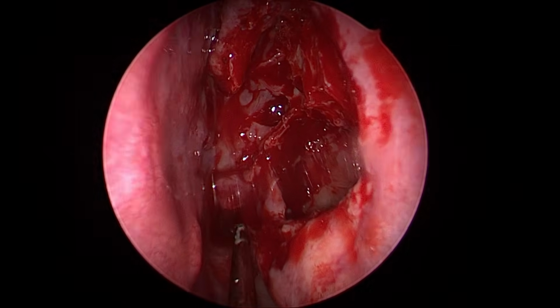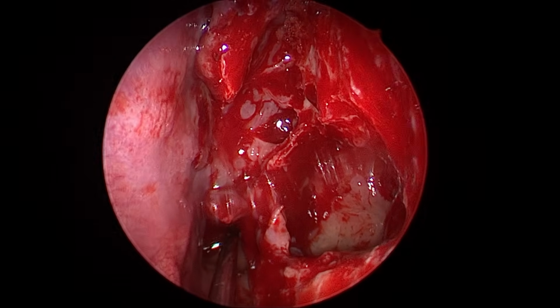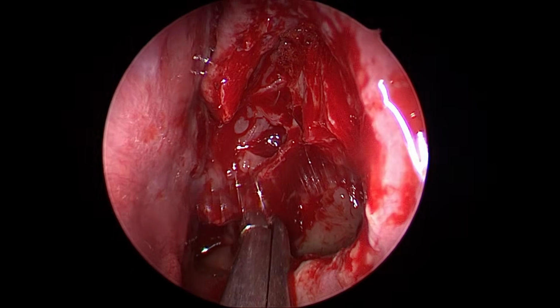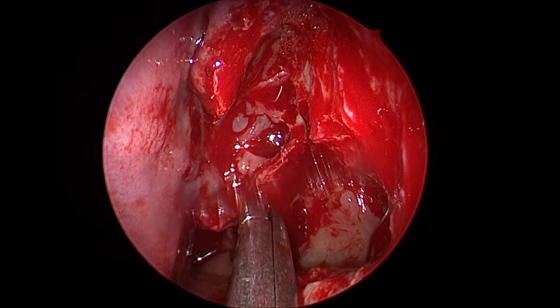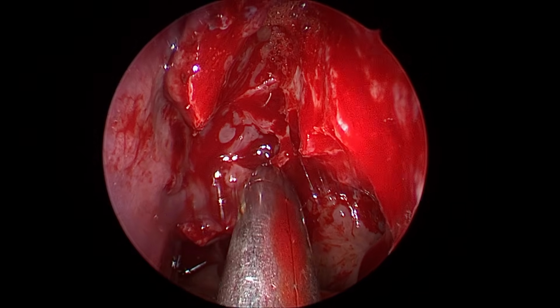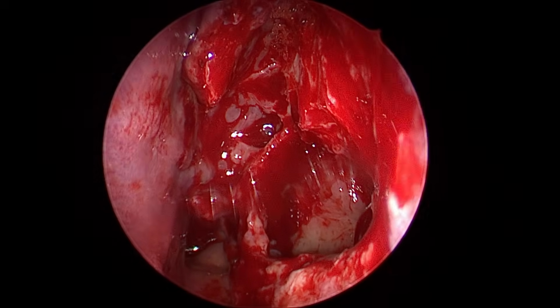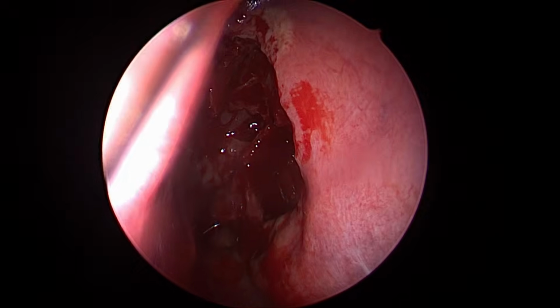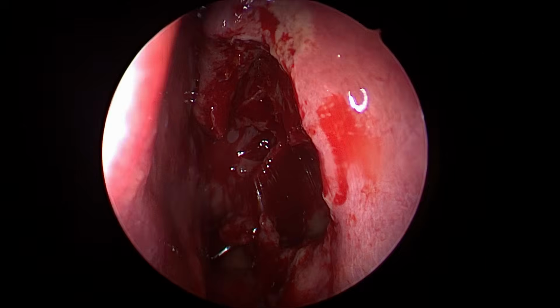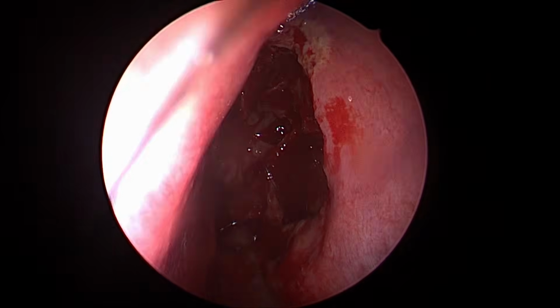In any given situation, there should not be any surgical fault in allowing the steroid to reach the mucosa adequately. The goal of surgery is to give a good access. See the maxillary middle meatal antrostomy now. Now imagine, this is with 0 degree.